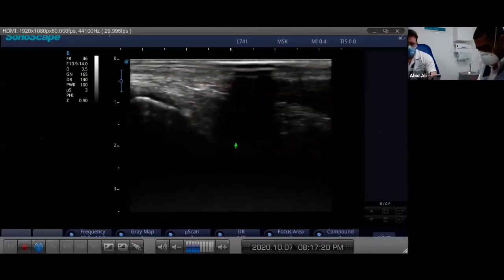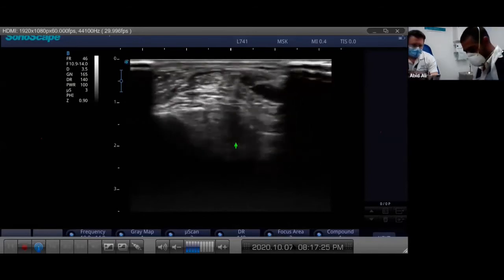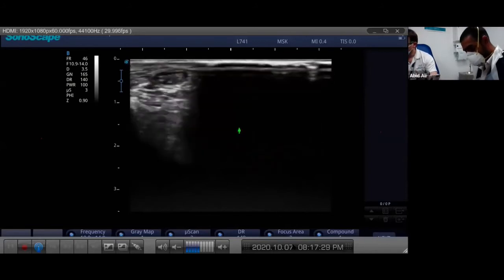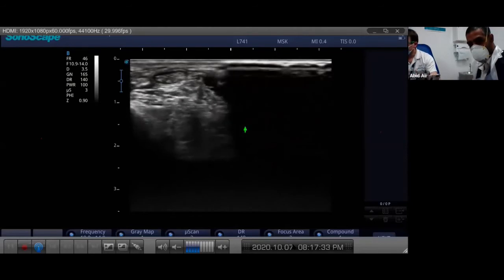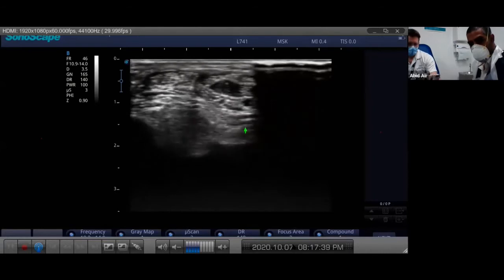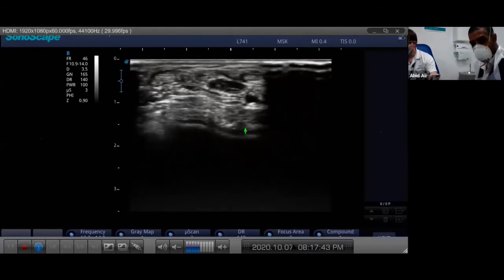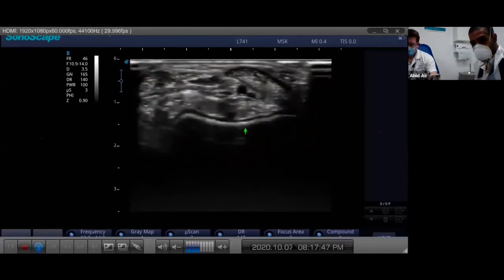You see how superficial everything is - there's very very little flesh, it's tendon, skin, tendon and pretty much the bony architecture. We're pretty superficial here. We pass right back over the anterior ankle. Let's go back to transverse - it's always best to start in transverse because you can pick everything up. Look how I'll just roll the probe rocking it like a cradle from medial to lateral - look at all those beautiful structures we can pick up.